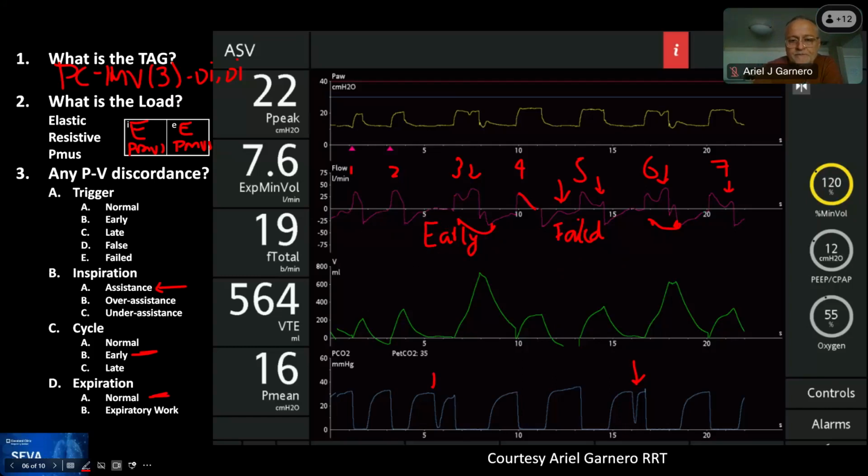Yep. All right. That's a fairly complicated way to do it, but you could, like I said, just put on this ventilator PC-IMV plus, and then you activate P-Sync, right? And with P-Sync, this becomes IMV2. So now you have both your safety and your comfort, and you just wait for the patient to suppress the mandatory breaths with the spontaneous breaths.